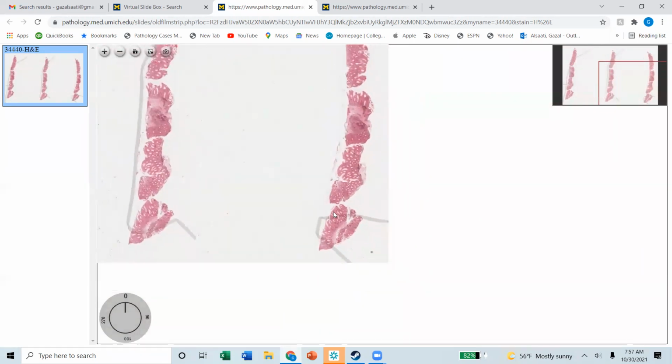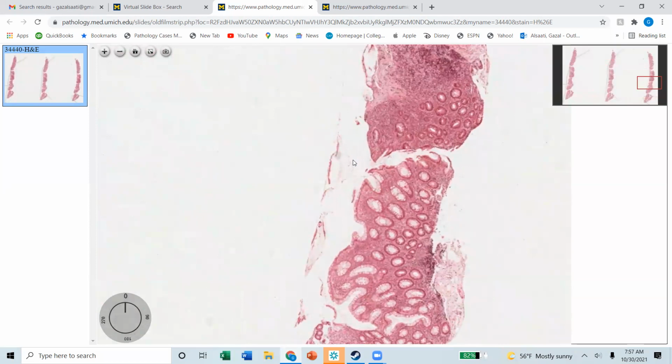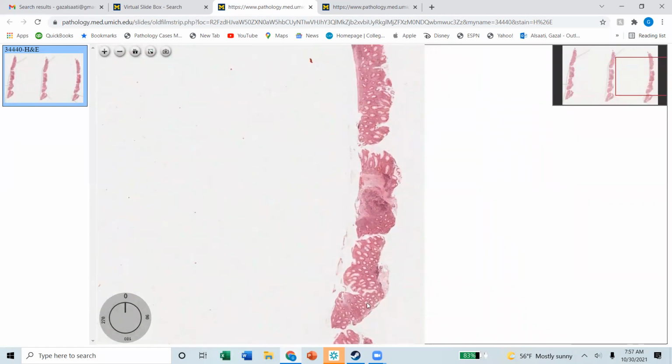So these are the items. And then, how do you grade your mild, moderate, severe? Can you elaborate on that? Say that again. How do you grade your activity, mild, moderate, and severe? Yeah, so I will see how many pieces I have, okay? And I know that all these pieces have chronic colitis. However, if 2 of them have the activity, then I will call it moderate.